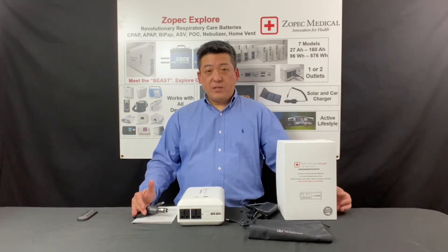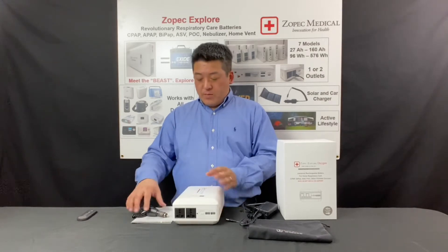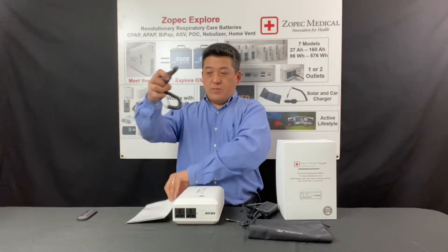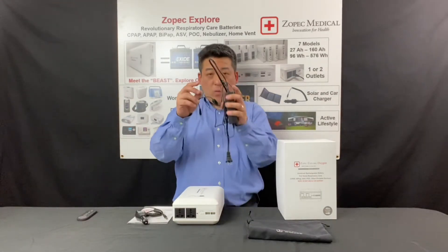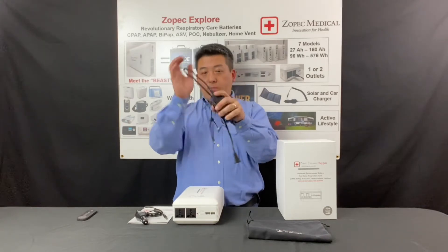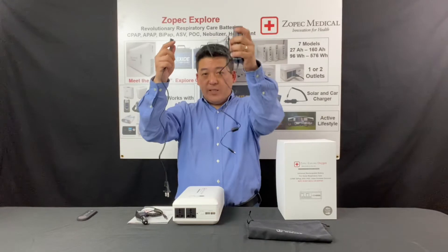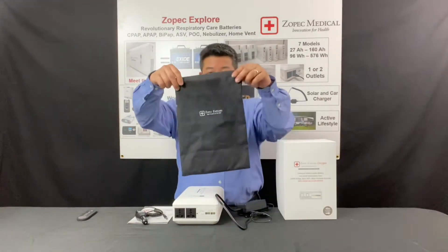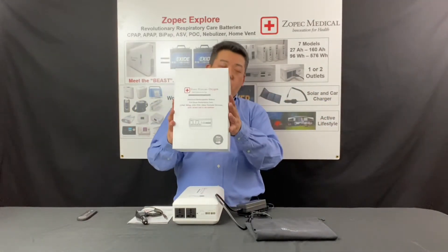When you receive your battery, you should have six different things. Number one is the battery. Number two is a user manual. Number three, a fast car charger. Number four, a wall charger that has two components — the plug and also the AC adapter, a travel pouch, and a nice storage box that it comes along with.